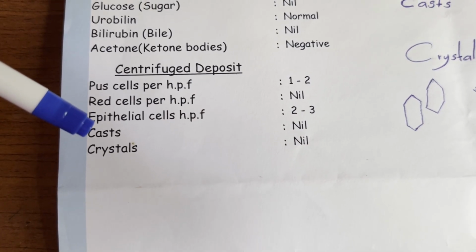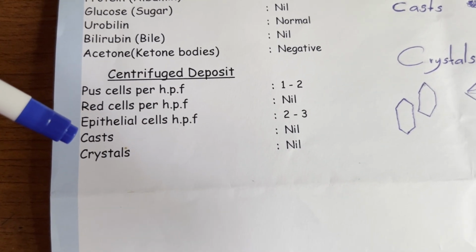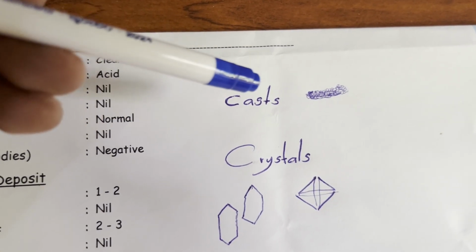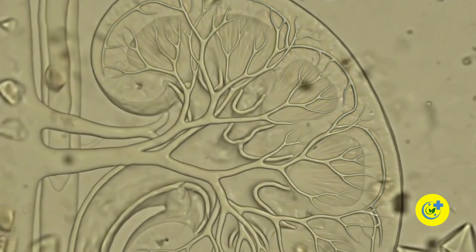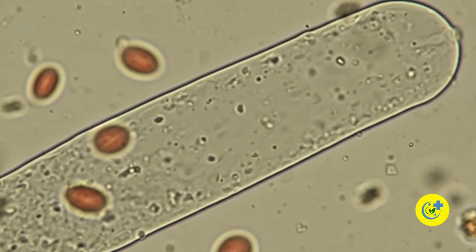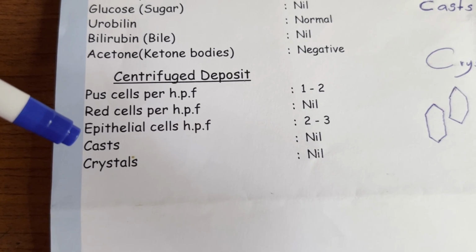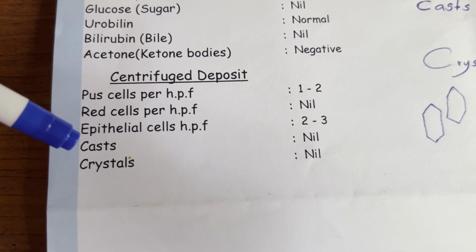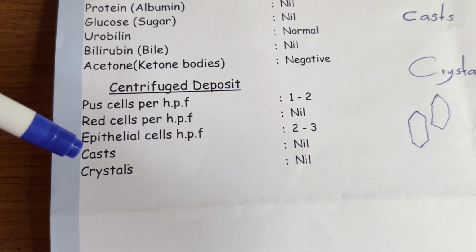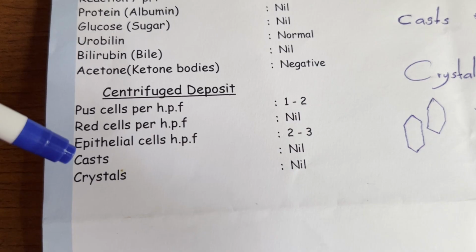Casts, red, nil. Casts are microscopic cylindrical structures formed inside the distal convoluted tubules and collecting ducts of the kidney, cemented together by Tamm-Horsfall mucoprotein. Their presence localizes the disease process directly to the kidney parenchyma. RBC casts are a diagnostic marker for acute glomerulonephritis. WBC casts distinguish upper urinary tract infections, pyelonephritis/kidney infection, from lower bladder infections. Granular/waxy casts are indicative of stasis and chronic renal disease.